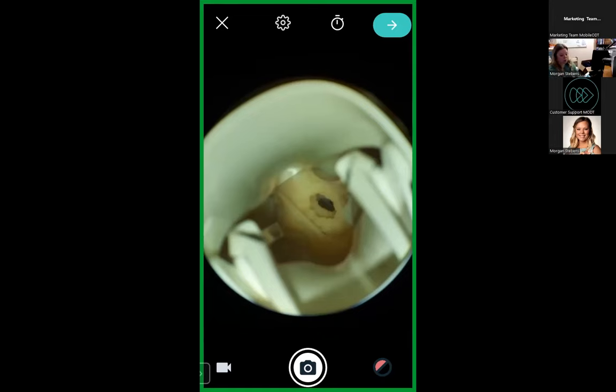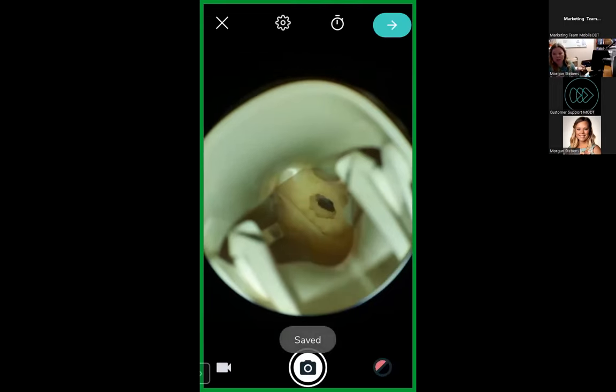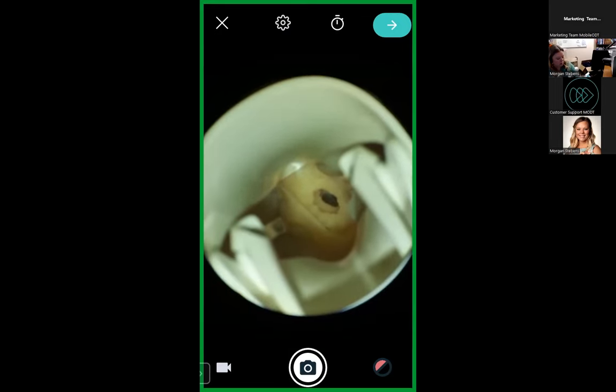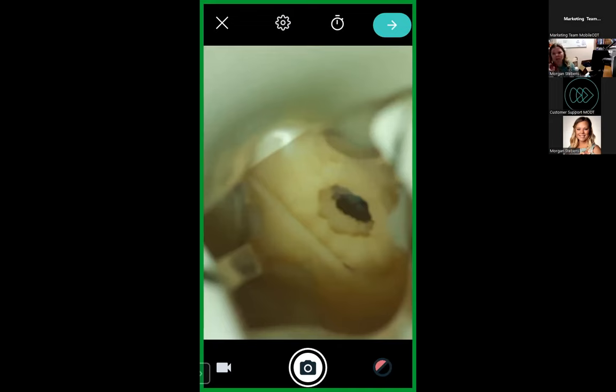So in this situation, I'm going to touch the screen to take a photo, and it moved a little bit, but that picture is just fine, right? So say I needed to get closer or I wanted to zoom in, you just would tap. See if my screen's going to let me do it. It's not going to let me do it. Okay, so your motion is the same as you would where you zoom on anything, but if you can't use your fingers because you've just touched tissue on somebody's genitals, that's not really beneficial. So that's why the pedal is really beneficial in this situation.